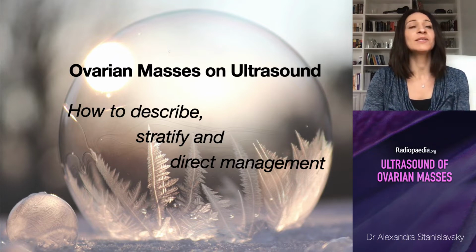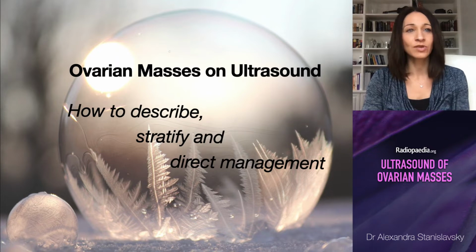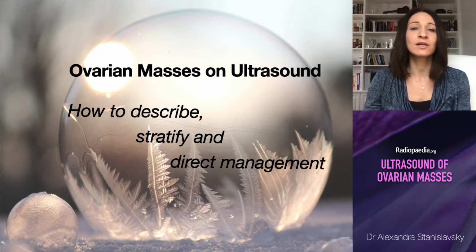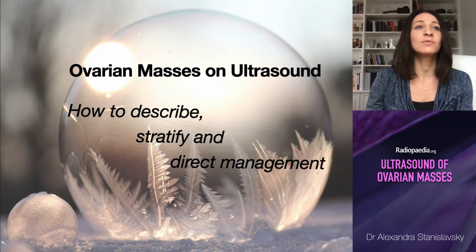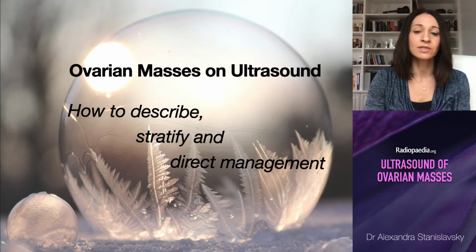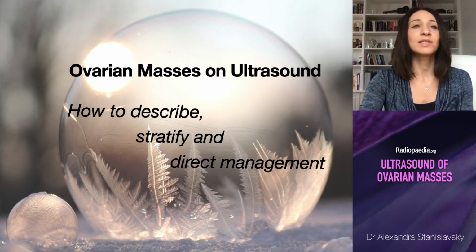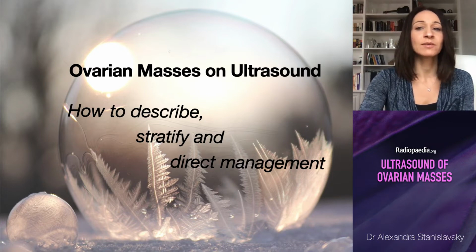And so we're going to be discussing today how to describe ovarian masses in a standardized manner, how to convey risk so that the report is useful in guiding the referrer. And to this end, we're going to go through several of the recent risk stratification systems. And we're going to talk a little bit about recommendations for management for best patient outcomes.